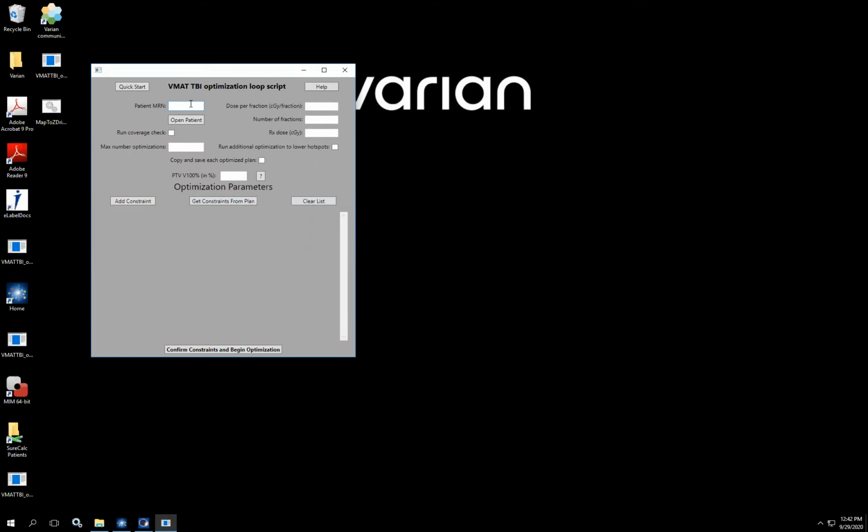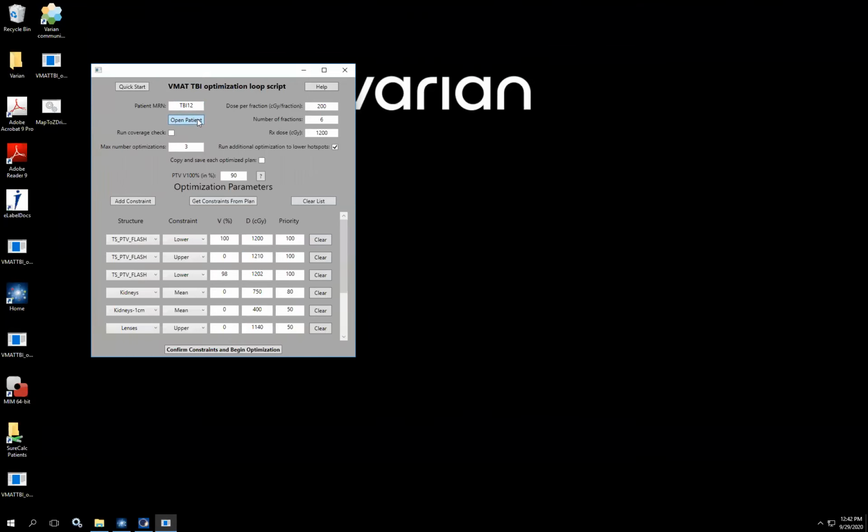And to start, you can go ahead and enter the patient MRN. So I'm going to enter a separate patient from the ones we worked on that I already previously prepared for use with this script. So we can go ahead and open them.